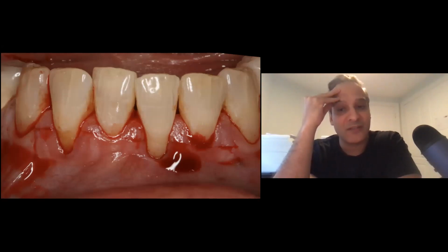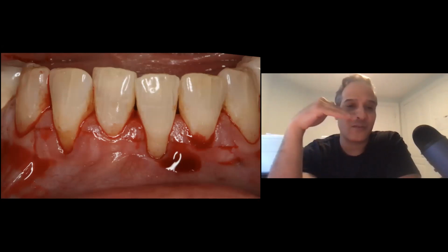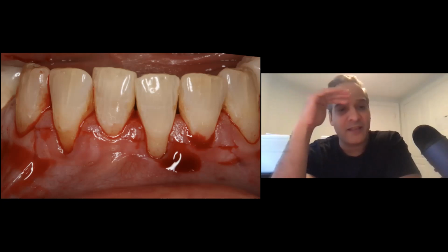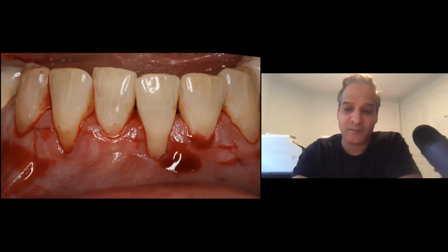So what I do is I outline with a horizontal incision first, and then two little mini vertical incisions to create my incision design. And then I angle my blade and peel off a little corner, and then I just do a very slow, sharp dissection with sweeping movements to be able to remove the surface flap, but still leave periosteum at the base, on top of the bone.